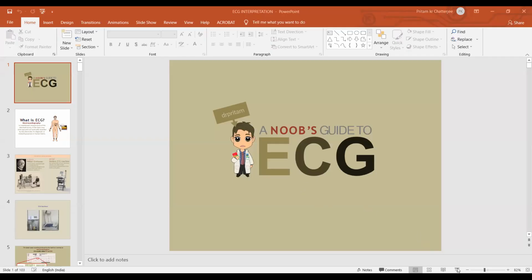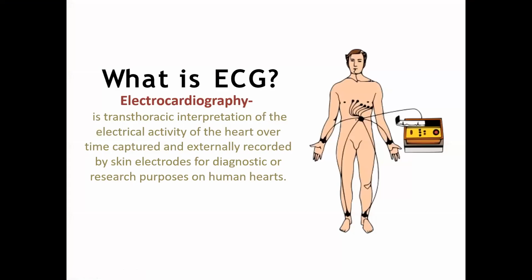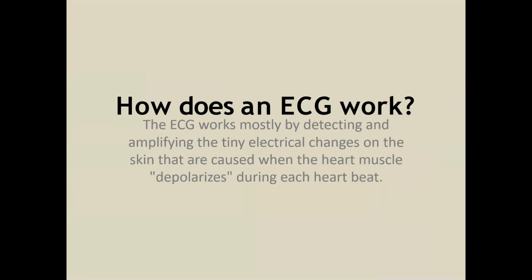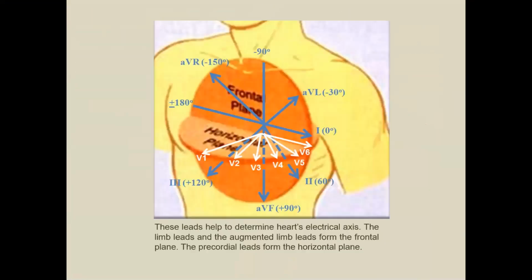So, guys, now I have already presented you the basics of ECG. Now, coming to the abnormal ECG findings you should encounter. What is ECG? I have already mentioned in my previous presentation, so I will not go through any of this. We'll start with the basics.